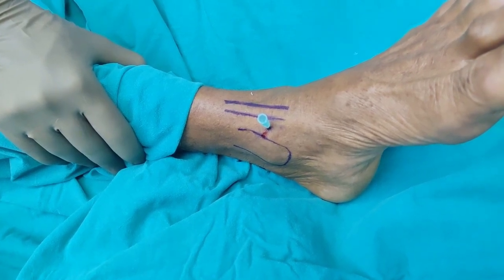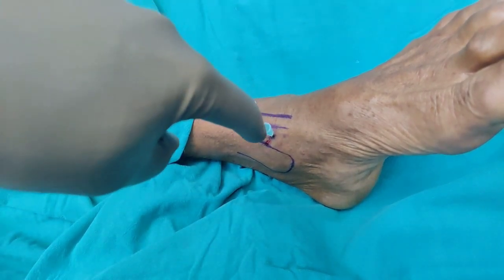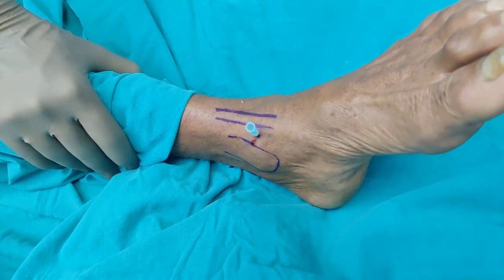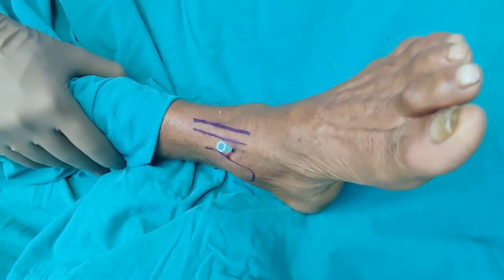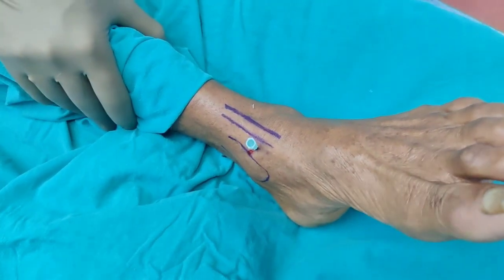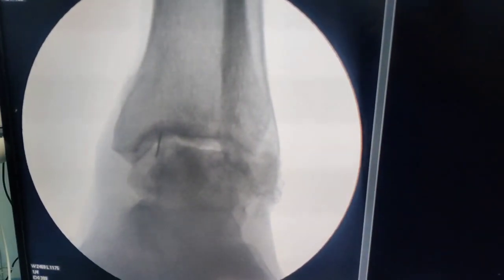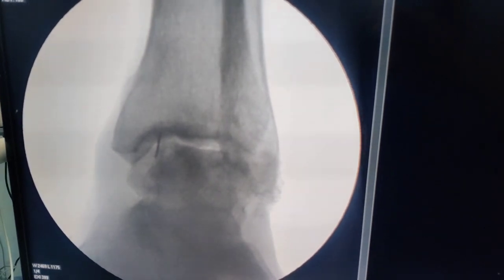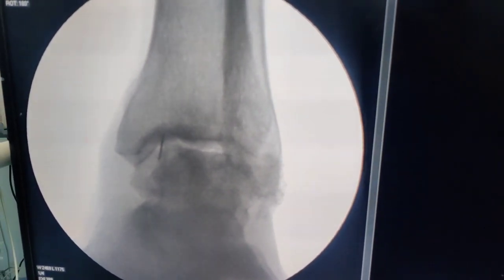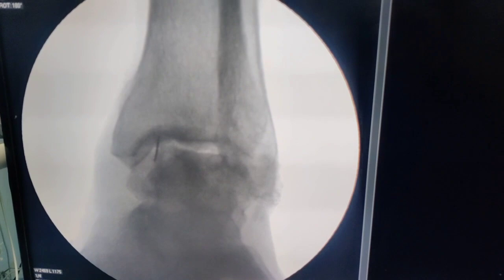Do not be shy in using the C-arm because you want to inject in the right spot. You can see that the needle has gone in absolutely perpendicularly — if you view from a different angle, it has gone almost vertically. Looking at the fluoroscopy images, our needle is into the ankle joint, just over the intermedial aspect, maybe touching into the medial gutter. I am going to put some OmniPaque — when you are in the ankle joint you will definitely feel a give-away that you are into the joint.